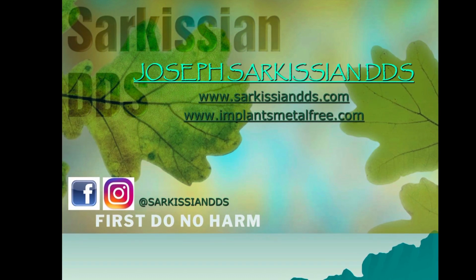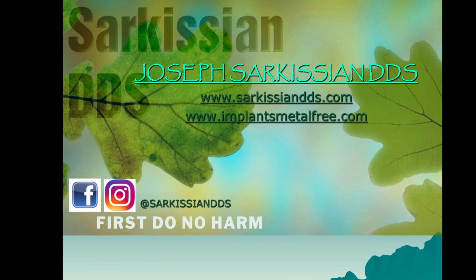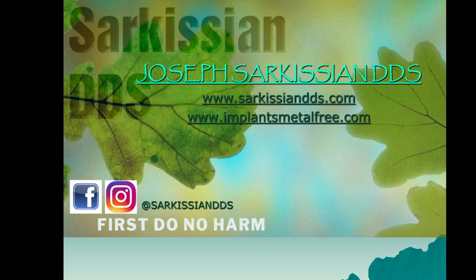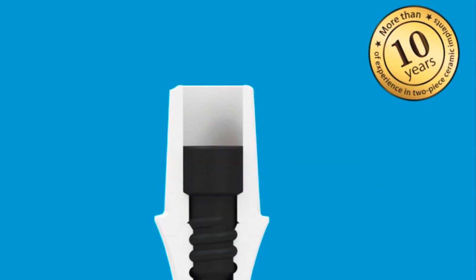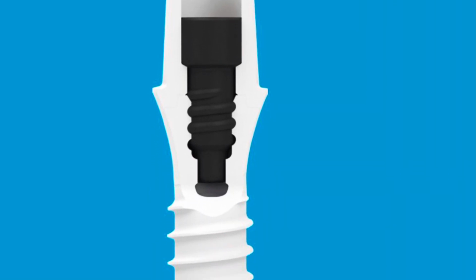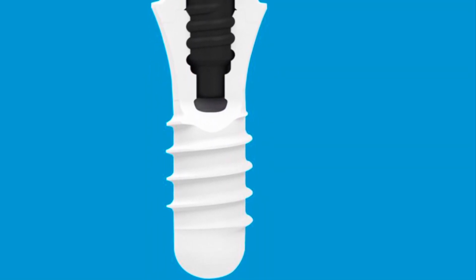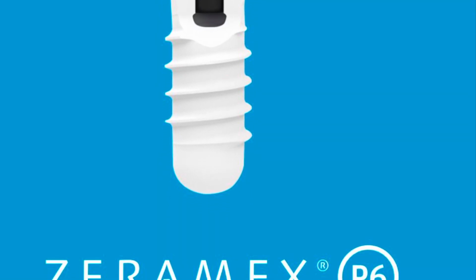Hi everyone, this is Dr. Sarkisian. In this video, I will be placing a Zeramex Zirconia ceramic implant and extracting two failing root canaled teeth with a ridge preservation graft. I chose to use the Swiss-made P6 Zeramex implant, which resembles the Straumann Standard Plus model. It is fully metal-free, made of zirconium dioxide, and is placed slightly above bone level.